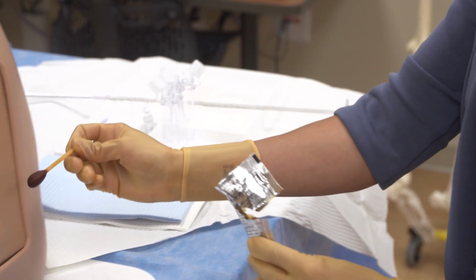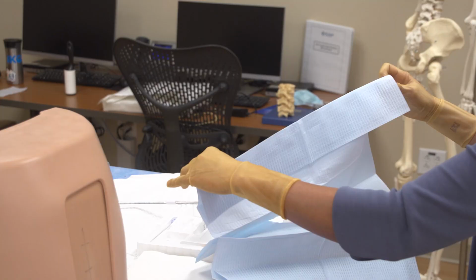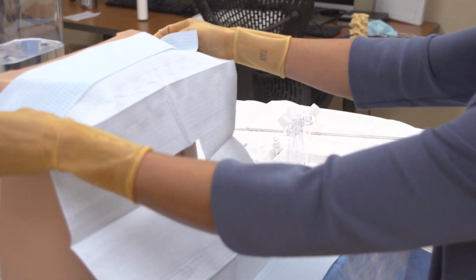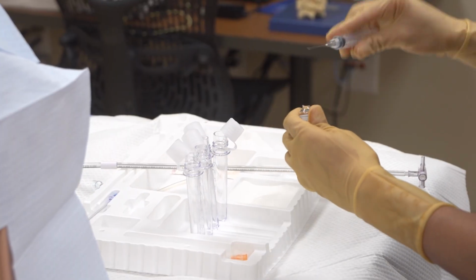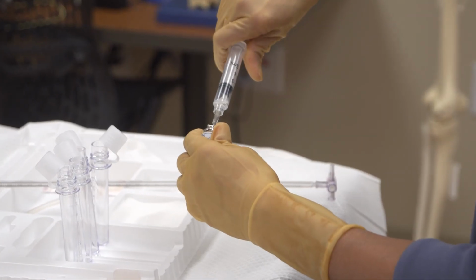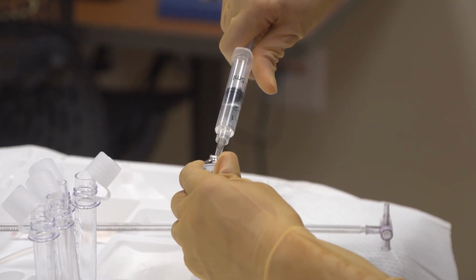Use the betadine swabs to clean the skin using a spiraling swabbing motion over your mark. Place the fenestrated drape centered over your planned needle insertion site. You may extend your sterile field with the white towel included in the kit. To anesthetize the patient, drop the lidocaine into a syringe. Some kits may include a filter needle. It is preferable to use that filter needle when available.